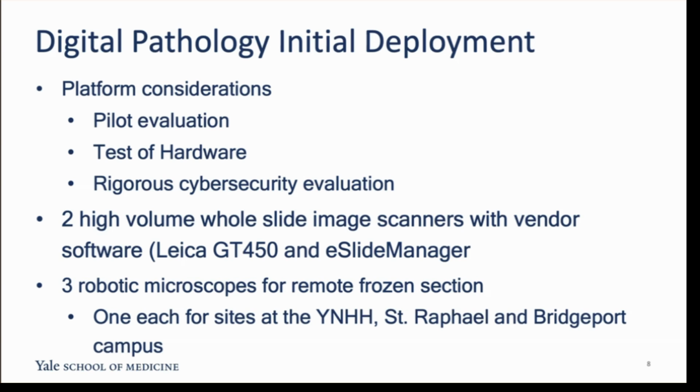Prior to obtaining all of this hardware, we actually did pilot evaluations, and part of the reason to do the pilot evaluation was to see if we like the product, the test of the hardware, and so forth. But at the same time, there was also the second piece where the information technology people looked at the security aspects of it. And indeed, there were platforms that we actually liked from the department side that were a no-go because hospital IT was not happy with the security aspects of those platforms.